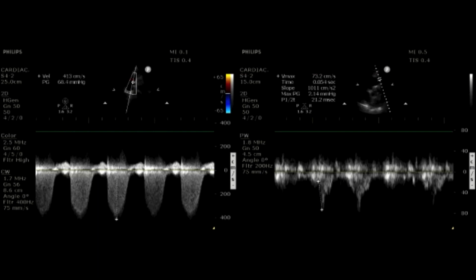It can also make you bleed to death. It's possible, but this is the risk of dying without it. This is the risk of dying with it. And here we are. I think in the absence of any other good explanation, I think PE is what comes to mind. So yeah, I would agree with that.